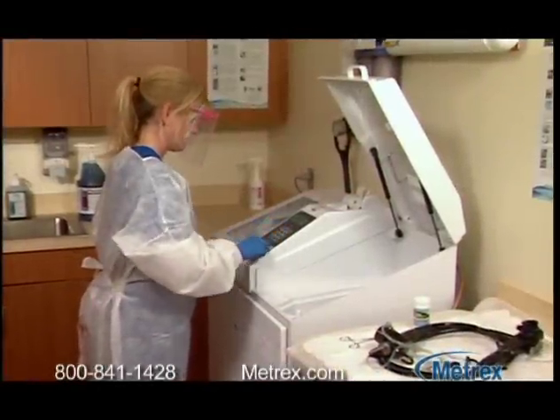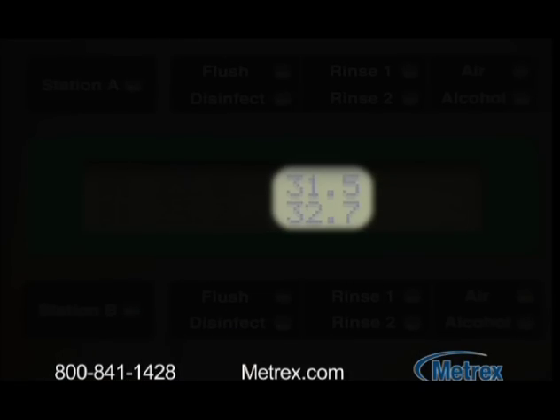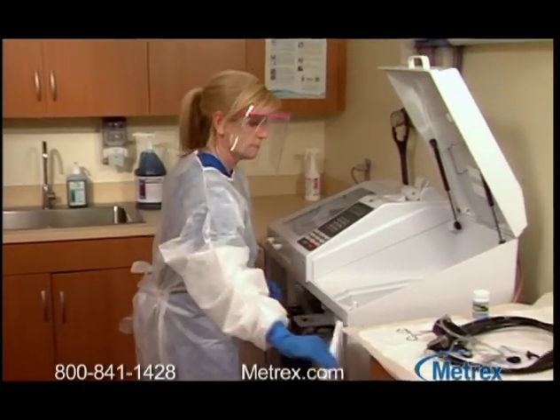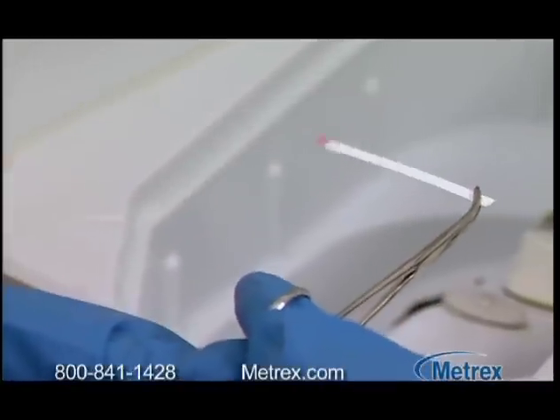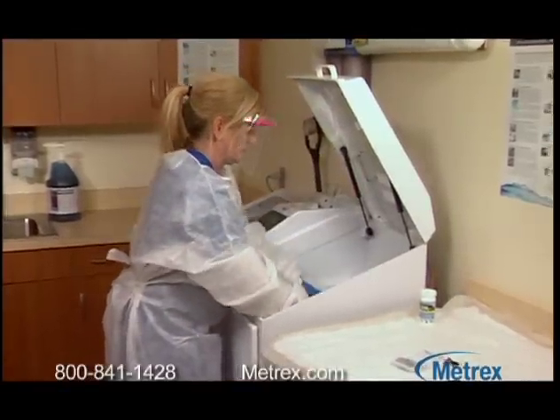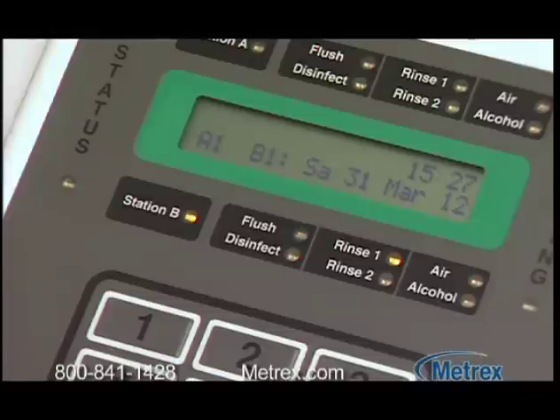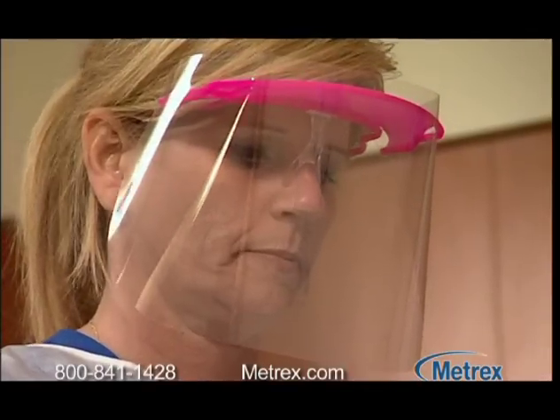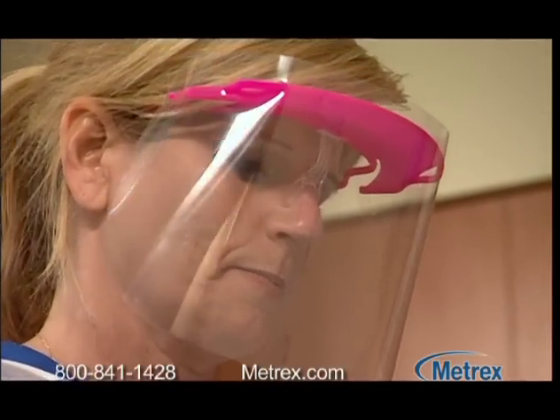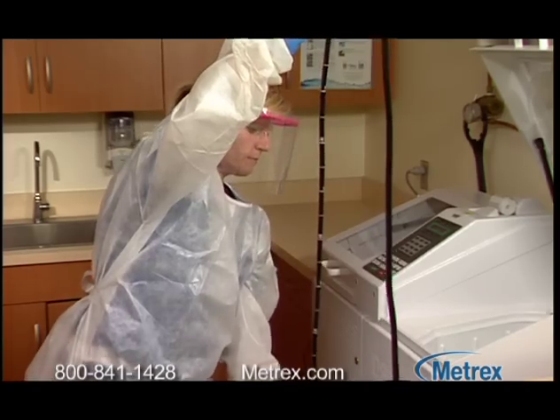If you're using an automatic endoscope reprocessor or AER, set the temperature to a minimum of 25 degrees Celsius or 77 degrees Fahrenheit with an immersion time of five minutes for high-level disinfection. Using a Metricide OPA test strip, test the solution to confirm an MRC level necessary for high-level disinfection. Insert the pre-cleaned and dried instrument, press start, and conduct the reprocessing cycle per manufacturer instructions. Select a rinse cycle validated for use with OPA-based disinfectants. Ensure that a fresh volume of water is used for each rinse and that each rinse lasts at least one minute. Refer to the manufacturer's labeling for any additional rinsing instructions. Dry the exterior using a clean lint-free cloth and either air dry or use medical grade air according to manufacturer's instructions.